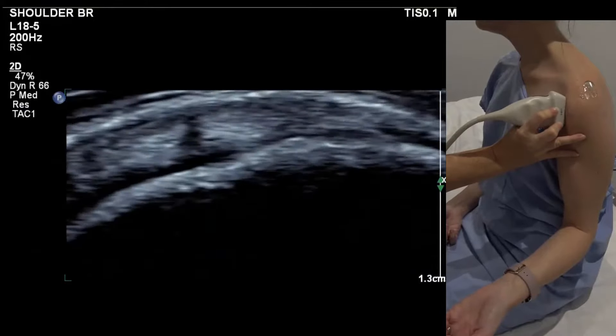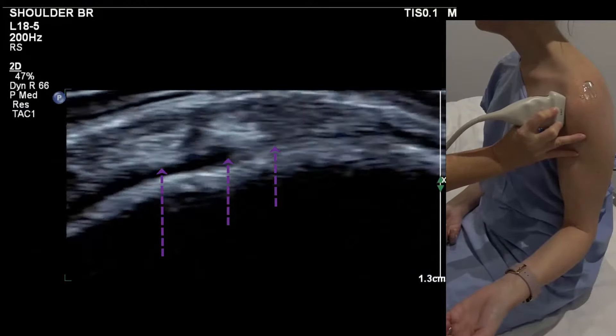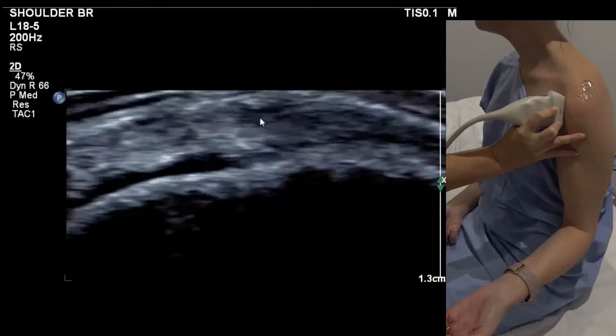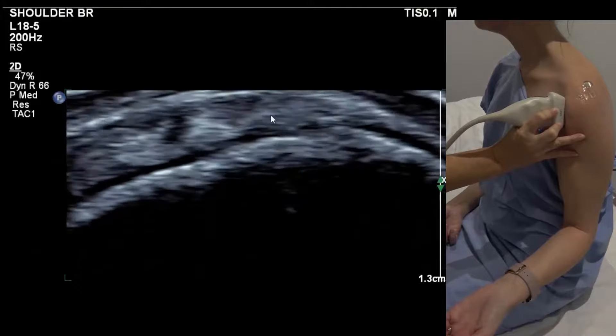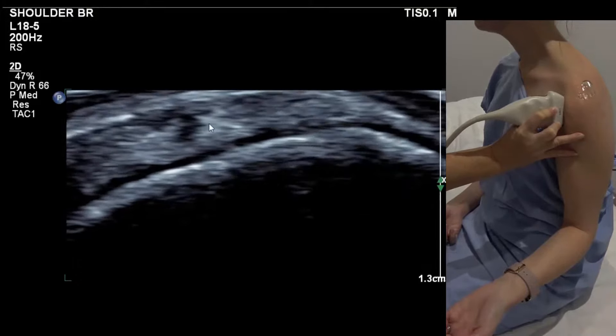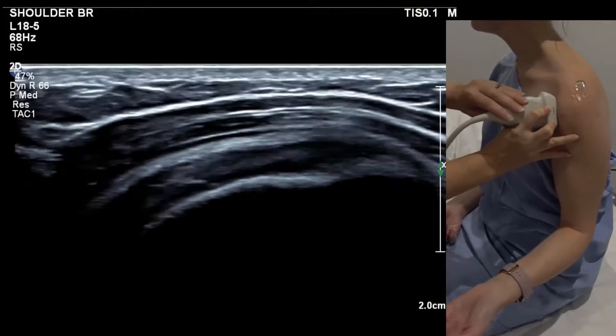You get these three bundles. In this patient it's a little bit hard to see, but there's one bundle with a black gap, then another bundle, then the lowest bundle. When imaging, we generally do three long images of the lower, the mid, and the upper.